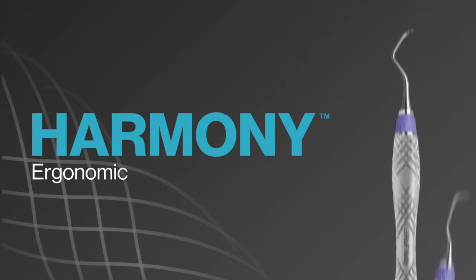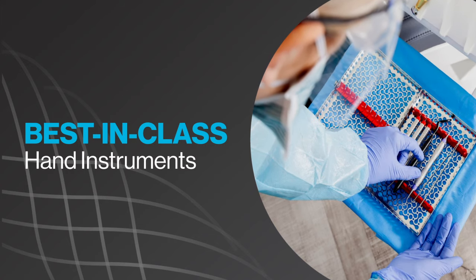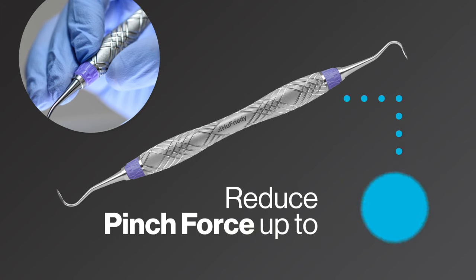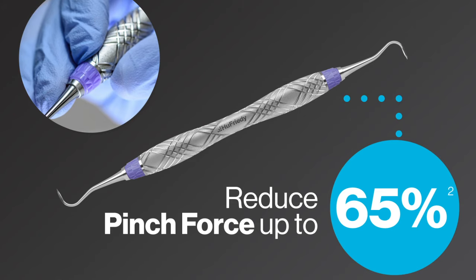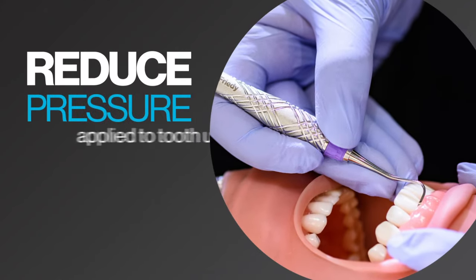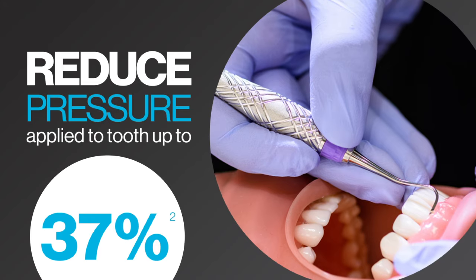Introducing Harmony Ergonomic Scalers and Curettes, your scientifically proven ergonomic hand scaling solution — the newest addition to our best-in-class hand instrument portfolio. Harmony Scalers and Curettes reduce pinch force by up to 65%, which may alleviate hand fatigue and injury risk due to repetitive motions. Harmony Ergonomic Scalers also reduce the amount of pressure applied to the tooth by over a third, which may increase comfort when scaling for both the clinician and patient.